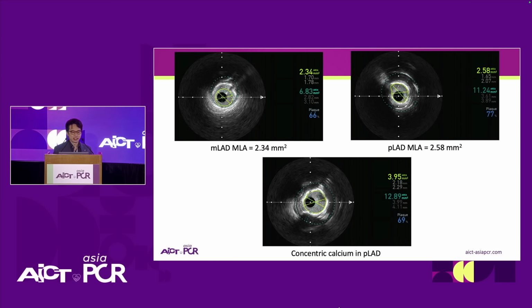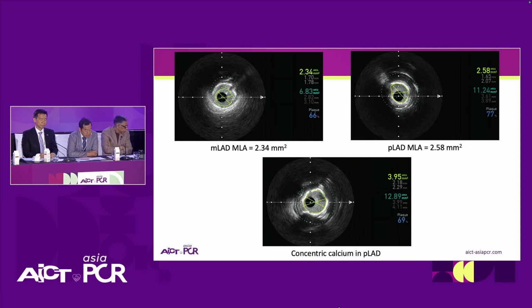Yep. So I think imaging is very helpful. In the standard practice would be to get the EEL reference distal. So in this case, the diameter averaging about 3.5 millimeters. So we halve that for the optimal burr size of 1.75. You may or may not want to go straight away 1.75, especially if you're just starting at rotor ablation. Maybe start with a smaller burr first and upsize. But about a step down of 50% from the reference EEL distally. That would be the standard practice. Okay, so you go half EEL diameter.